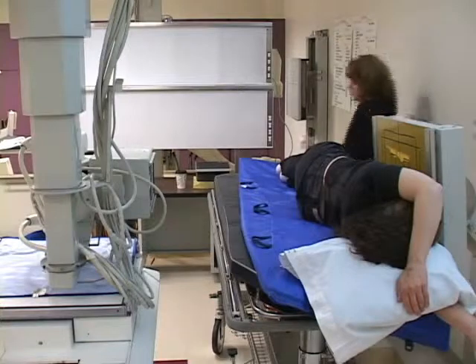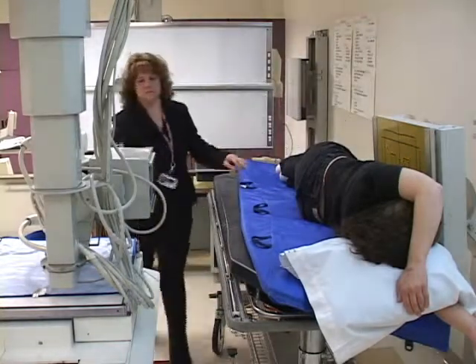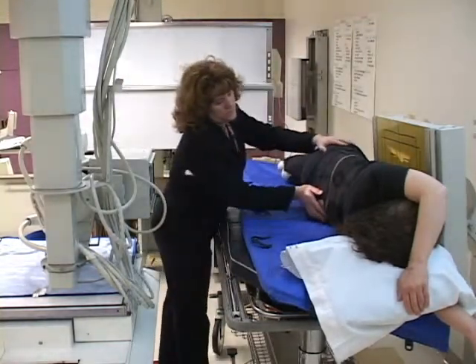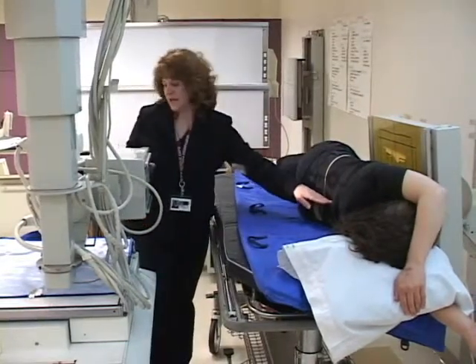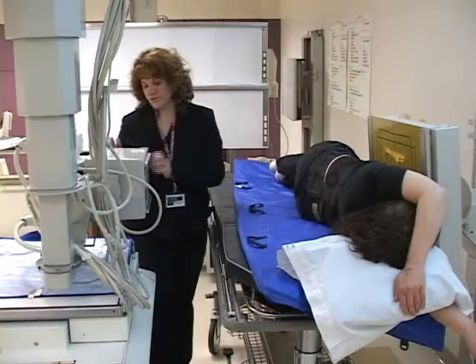There we go. Come back around. Okay, we'll roll her up. And I'm going to enter, this one's actually easier because I can actually center right to the middle of her spine.